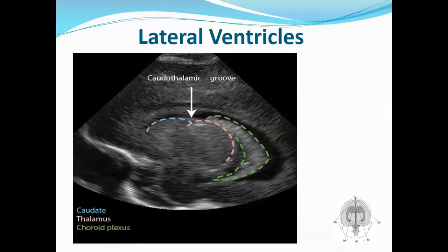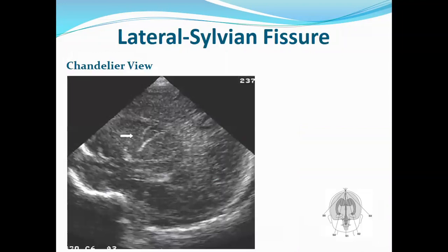But if you want, others would go further, and do what they call the chandelier view. If you remember, I talked about the Sylvian fissure. Others would want to demonstrate this Sylvian fissure in profile. It's not really important because you will get other important images.